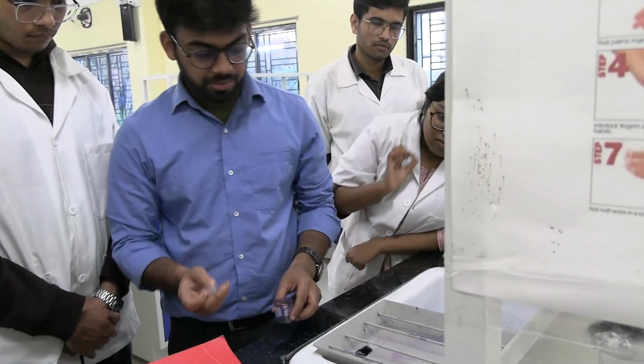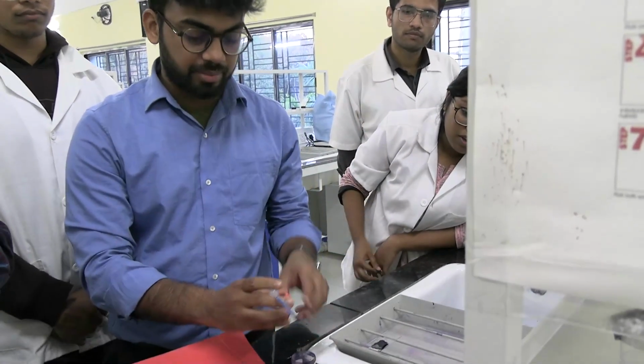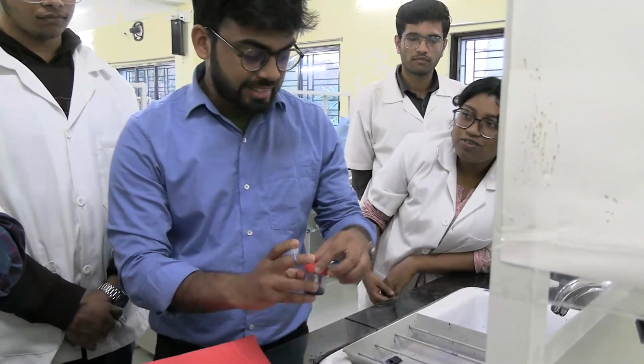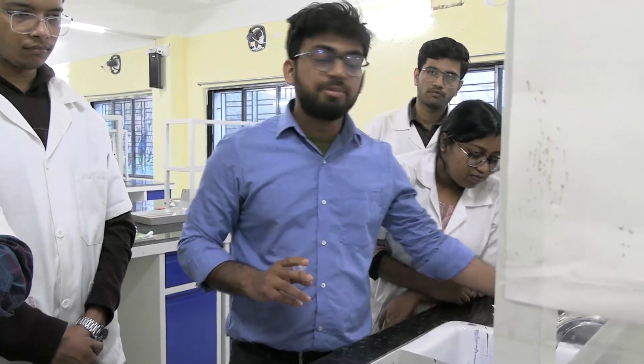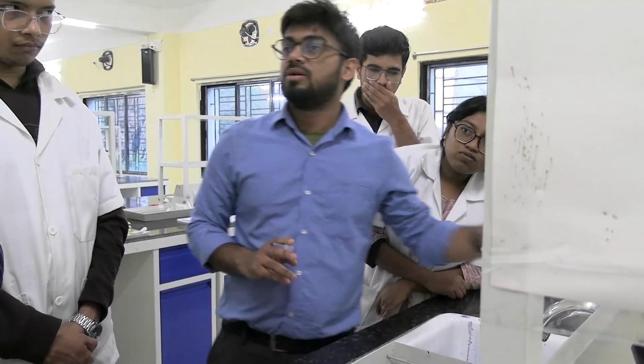What is this time called? Fixation time. This is not staining time. In these 2 minutes, what will happen? The smear will be fixated. Who will help in the fixation? Methyl. Yes, you are right. Acetone-free, water-free methyl alcohol. Why is it acetone-free?